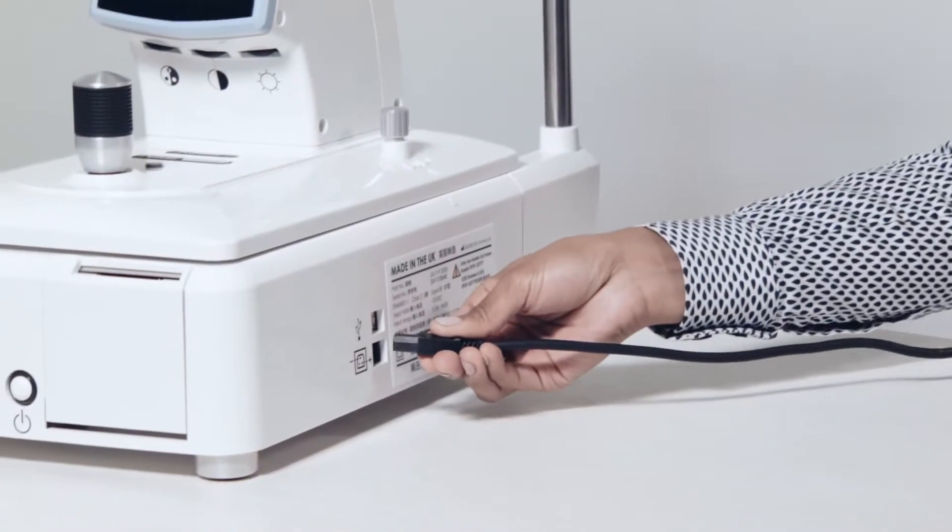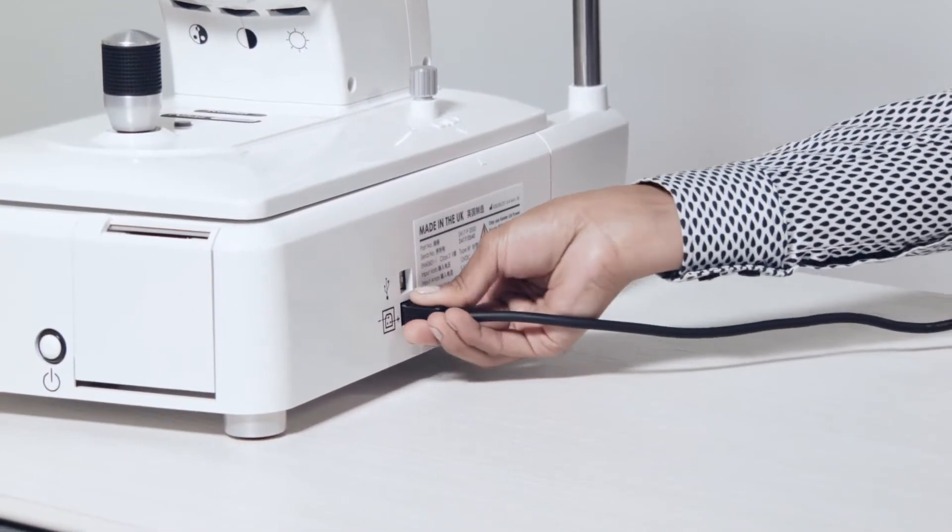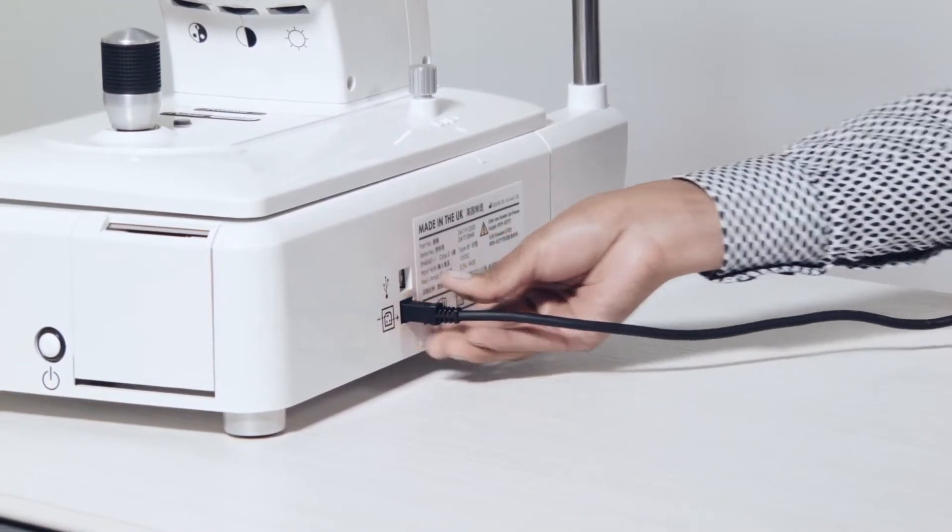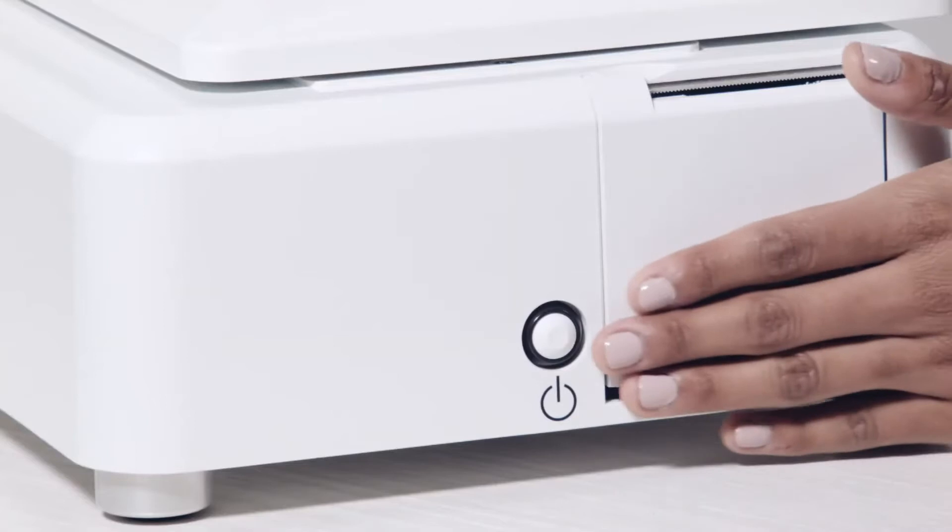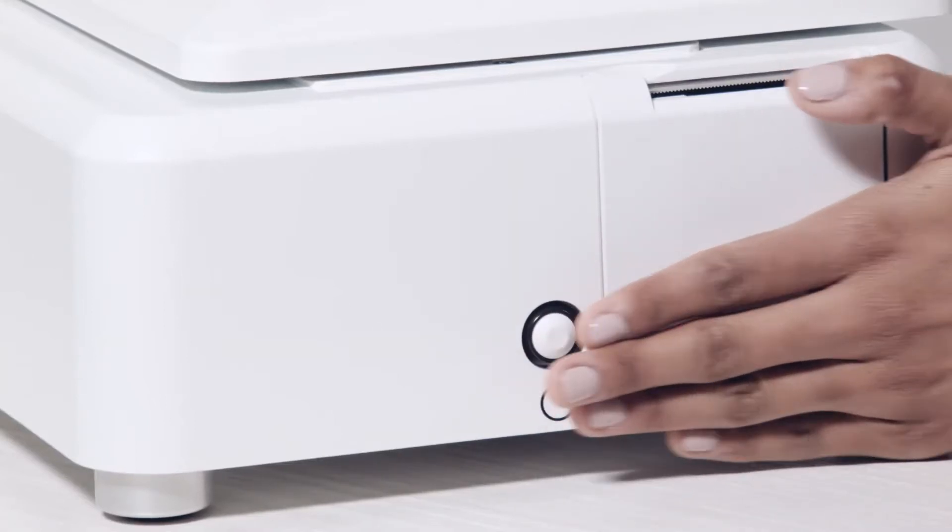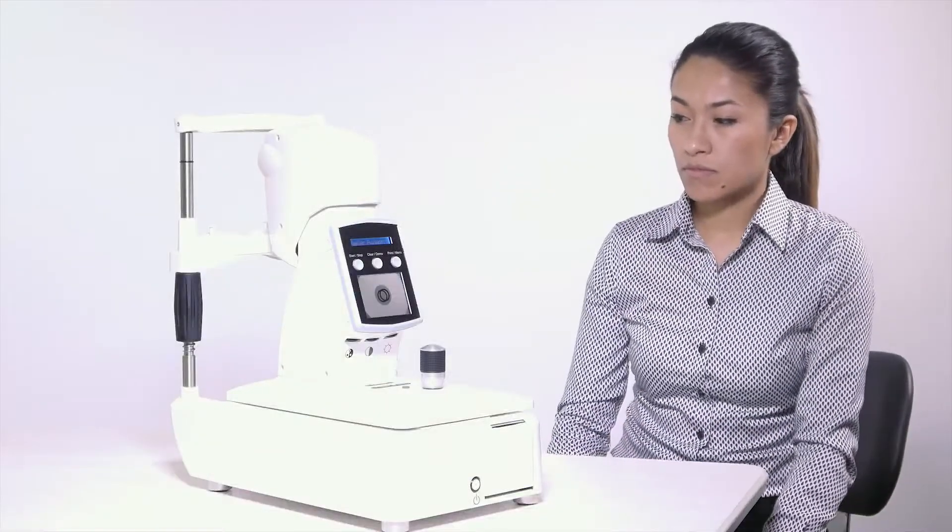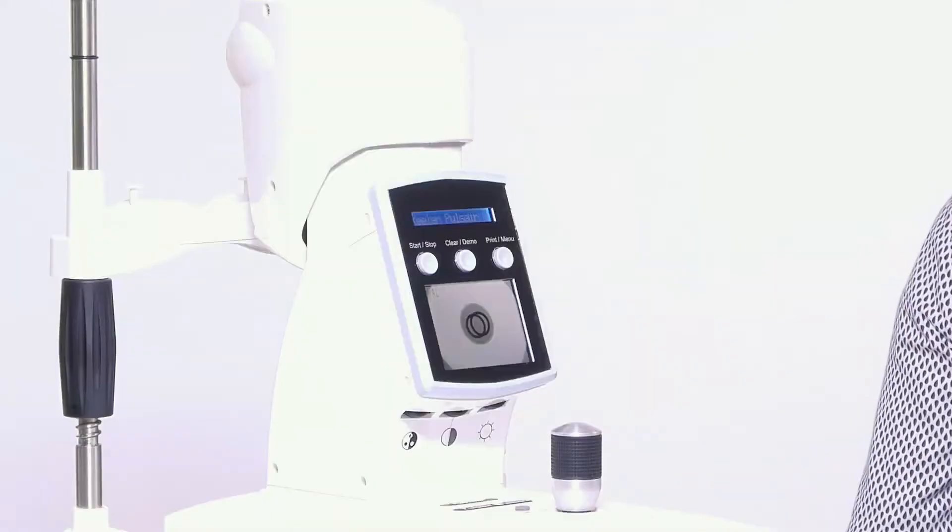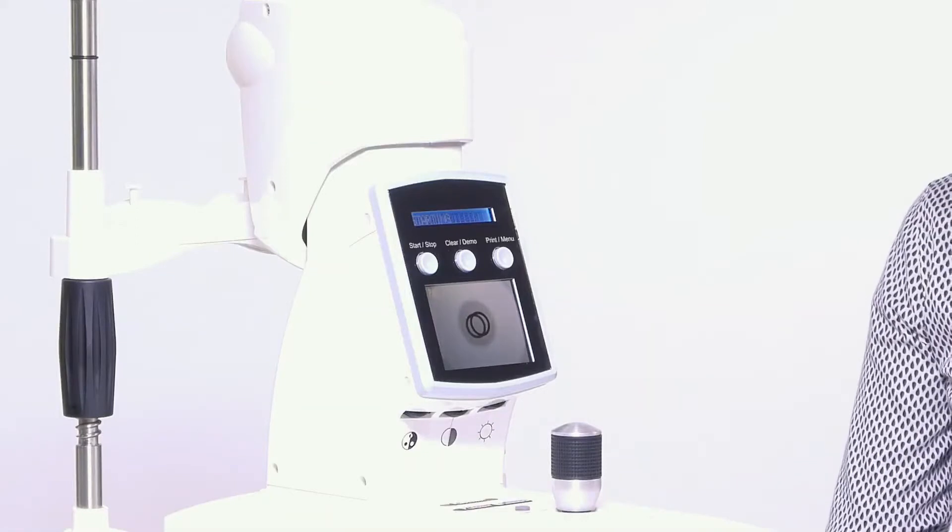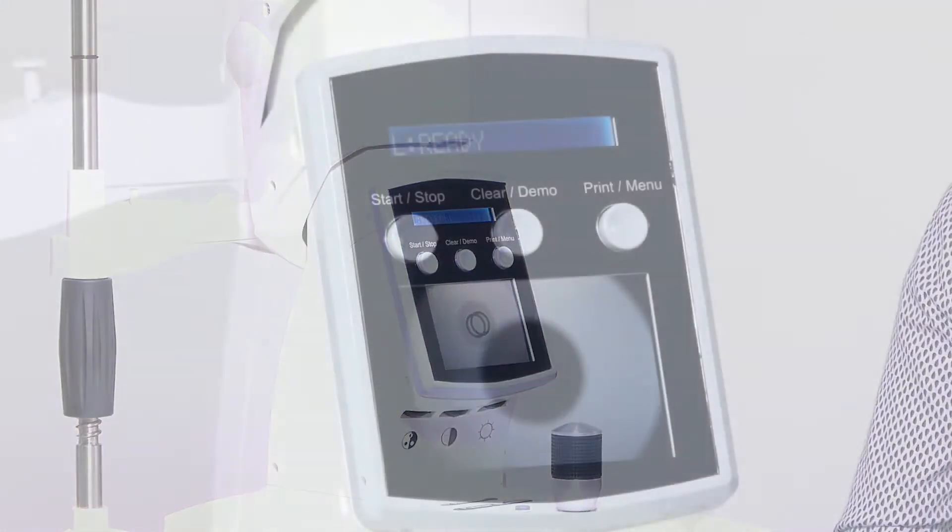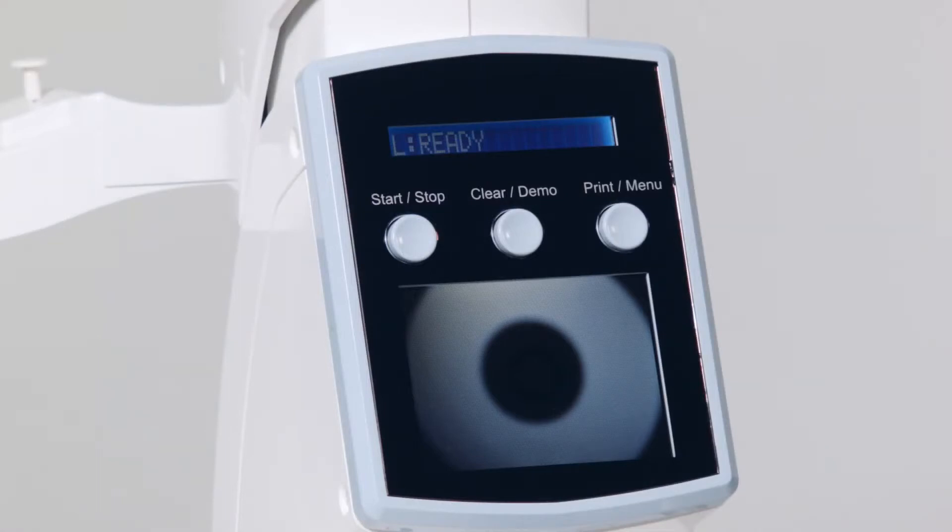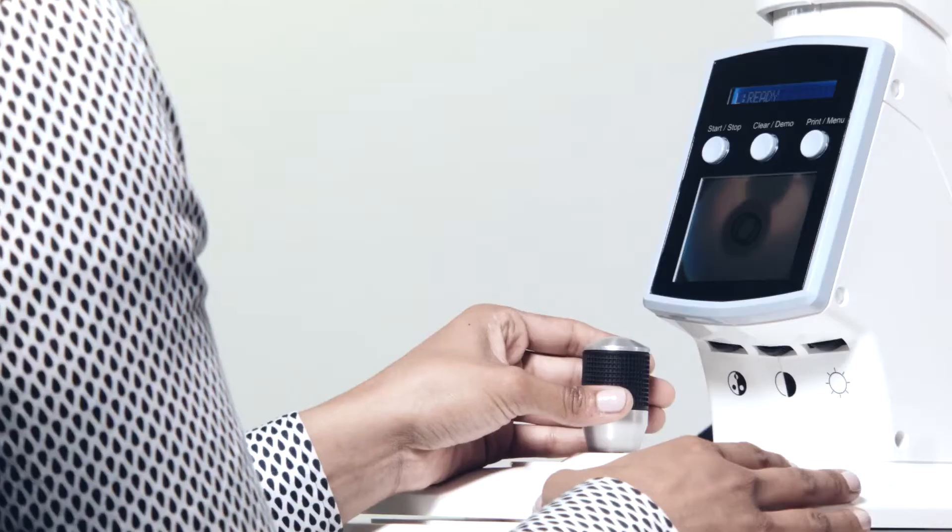Plug in the PulseAir prior to use. The on-off button is located on the side. Once the on button is pressed, the instrument will progress through an initialization series. When the system is ready to use, the display will read L ready or R ready, depending on whether the tonometer is in position.